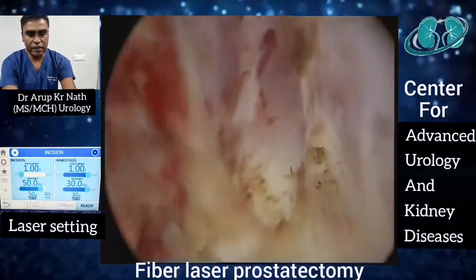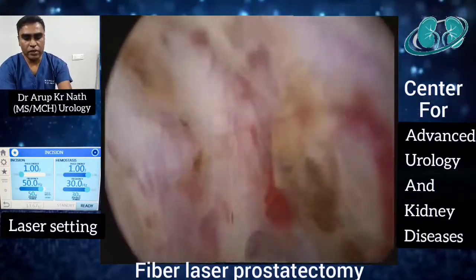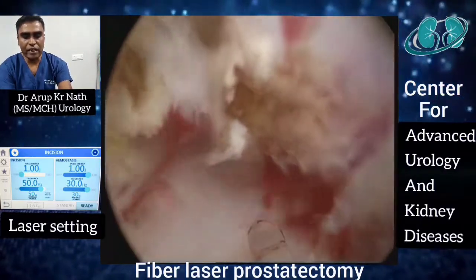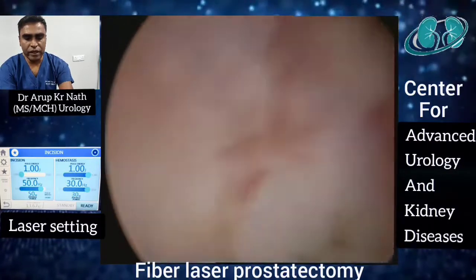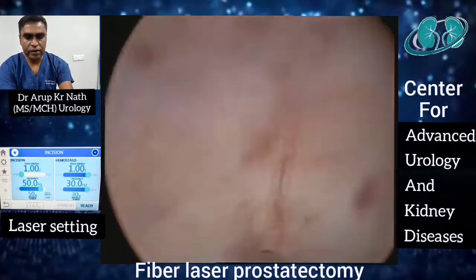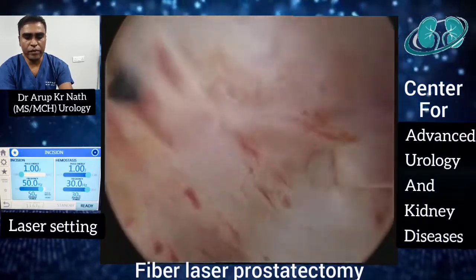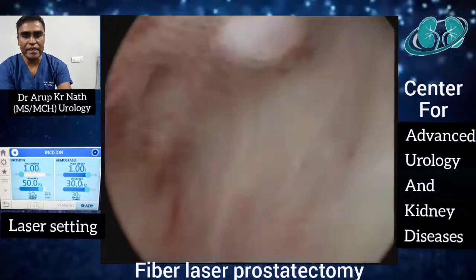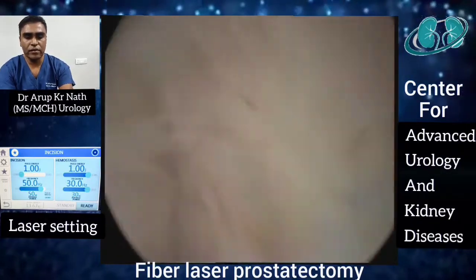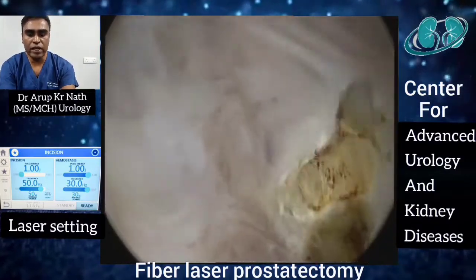You can see the laser fiber just emerging out of the laser working element, and with mechanical force we enucleate the gland from the apex. You can see the small pinpoint bleeding coming from the very well-defined glistening prostate capsule, which is visible, and at that moment we can do pinpoint coagulation.